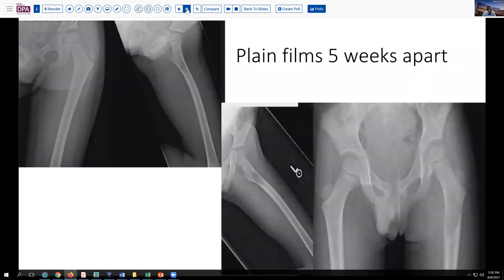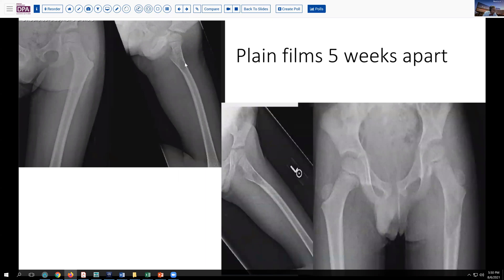Initial workup included some plain films, which we see here on the left. And as you can see, it's not terribly obvious. There's maybe a little haziness here in the femoral head around the greater trochanter, and here may be a little bit of lysis. The margins are not sharp. There may be a little bit of cortical destruction or damage here. This is kind of worrisome, but maybe not very specific at this stage.